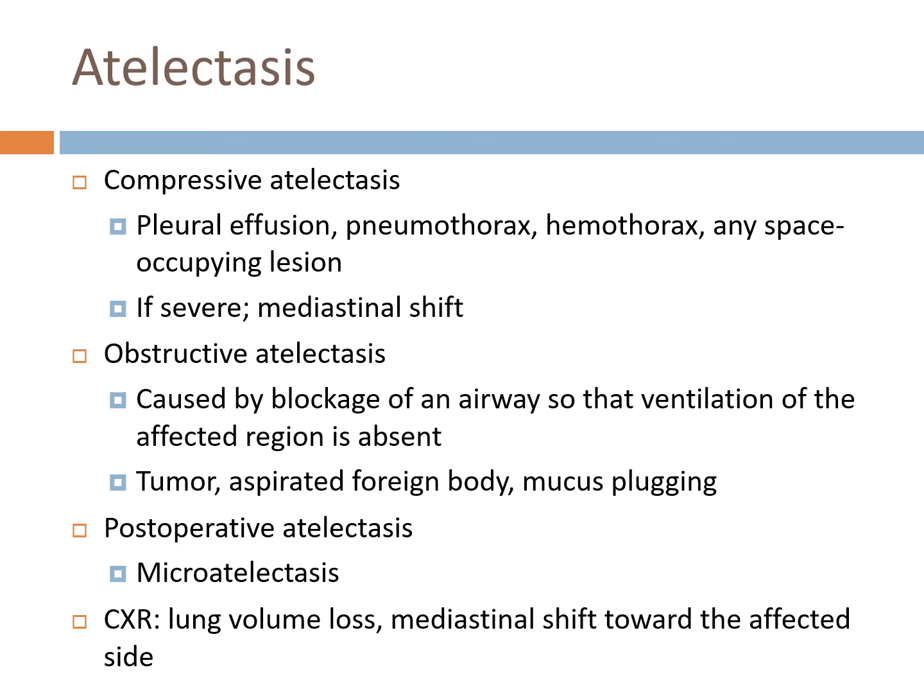If you have a severe enough atelectasis, you'll actually have a mediastinal shift because it's compressing on the mediastinum area and would be pushed towards the unaffected side. So the affected side would be pushing it towards the unaffected side.